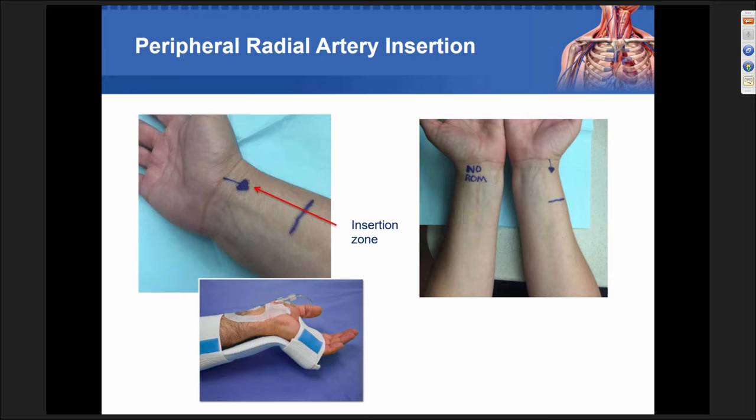And the arm board. I'm not a big fan of arm boards, and that's just me personally. I believe an arm board is a restraint, and by moving the position to a better insertion area, you can actually remove the arm board. If you walk through your ICU today and you're like, wow, we use arm boards on everybody, it's really an opportunity to move the insertion location to potentiate longer catheter dwell, but also reduce mechanical failure and make sure your catheters are very crisp and clear. So no arm board unless, through troubleshooting, you've identified a need for one. It should not be automatic.